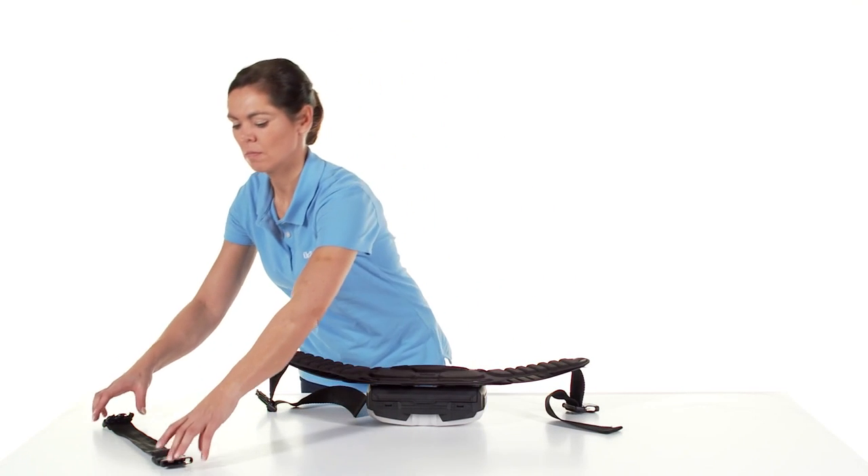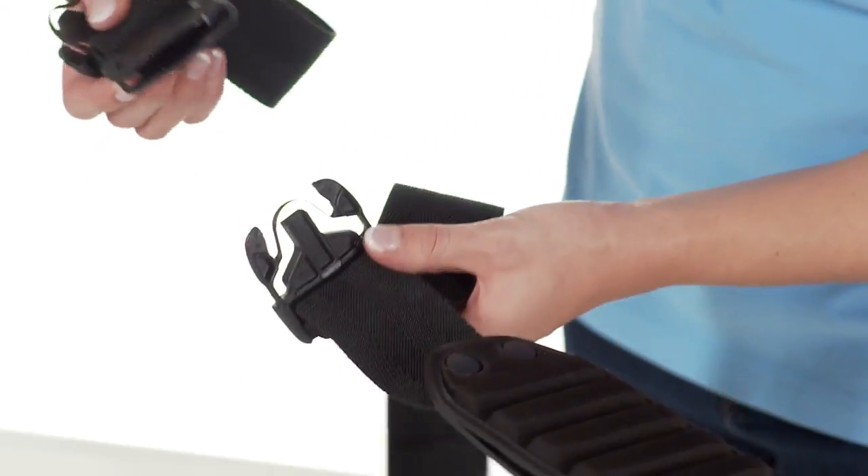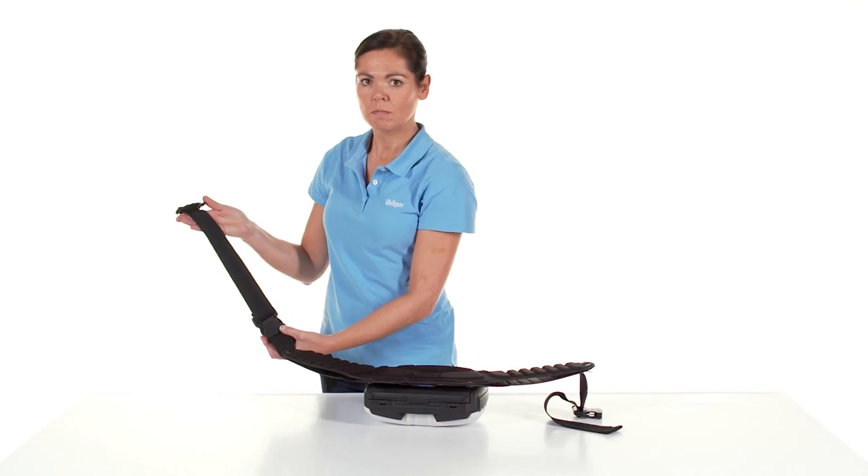If necessary, DREGA offers a belt extension. The extension can be easily attached to your belt and makes it longer.